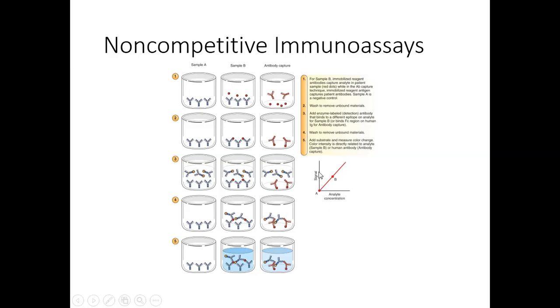If we went up to a higher signal change than even level B and read it over, and then down, our concentration of analyte is higher. High signal change means a high level of the analyte in solution. Those are directly proportional. Very straightforward. Does that make sense? Great. Hopefully it does. Again, come see me if you don't.